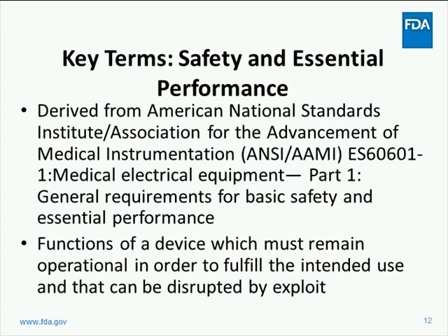The idea is that some vulnerabilities may create the potential for the compromise of the device functionality such that safety is compromised directly, while other vulnerabilities may affect functionality such that the compromise of safety is indirect and not readily apparent. Vulnerabilities that could potentially affect essential performance may or may not compromise the device such that safety is compromised, resulting in an unacceptable risk of patient harm. Manufacturers are responsible for defining the safety, critical functionality, and essential performance of the device.